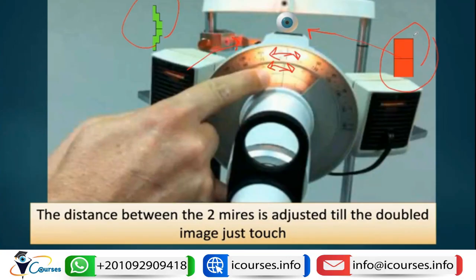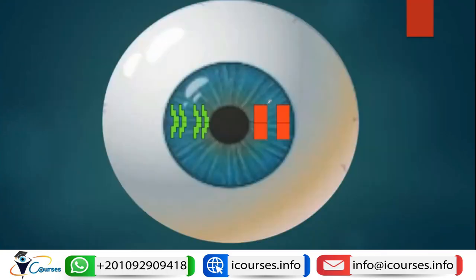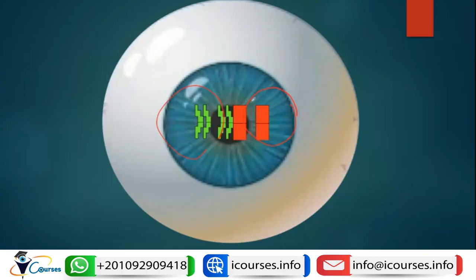When both the red square and the green staircase are well adjusted and well aligned, then we reach the fixed image size. Let's see an example. We have only one red square and one green staircase, but the Wollaston prism will cause doubling of each of them, doubling of the red square and doubling of the green staircase. So what is the object? The object is to move both of them in order to just touch each other. By moving both the green staircase and the red square, we are changing the object size. If we reach this orientation, then this is called the fixed image size.